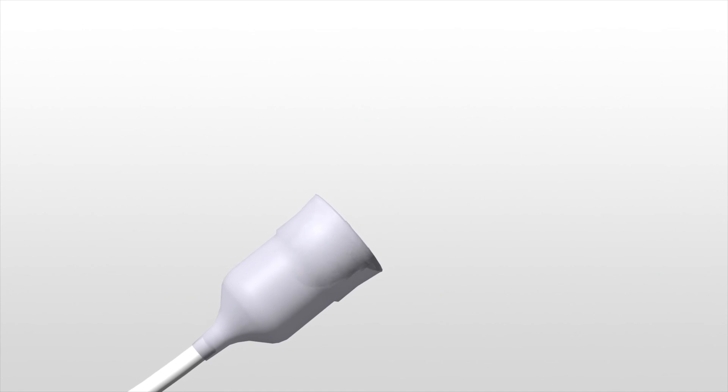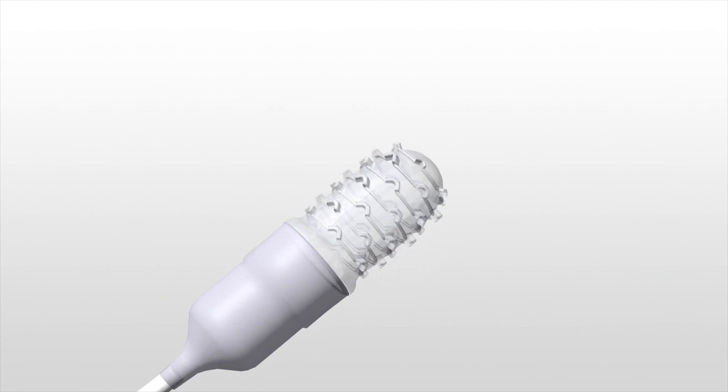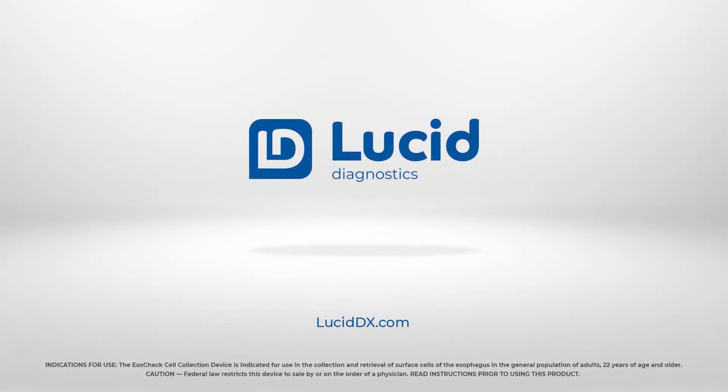ESOCHECK: a novel, non-invasive, 5-minute office-based procedure to safely and simply sample cells from the esophagus.